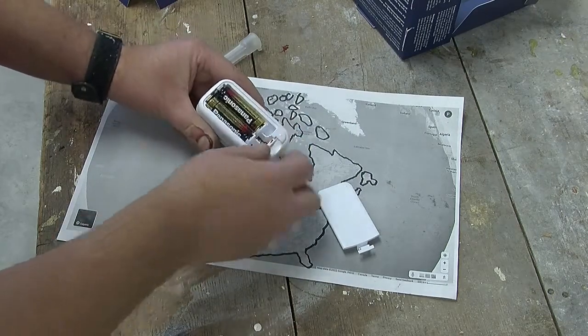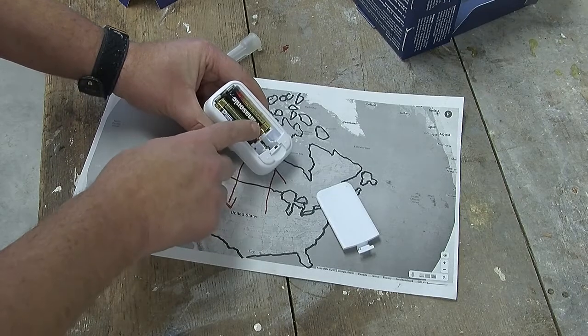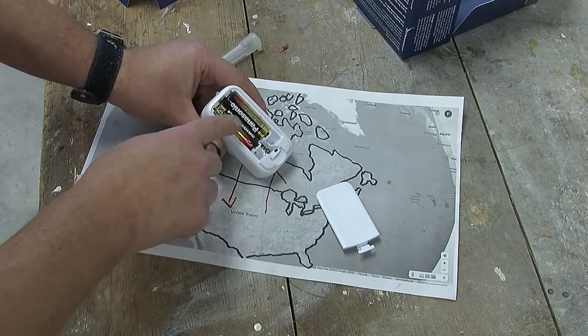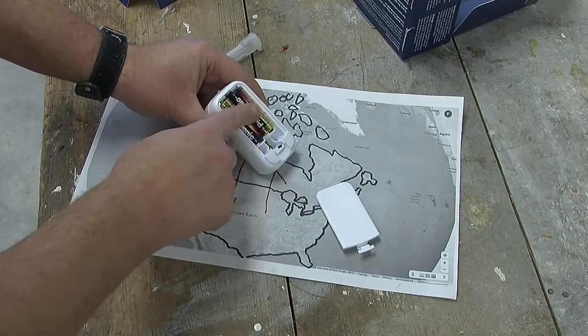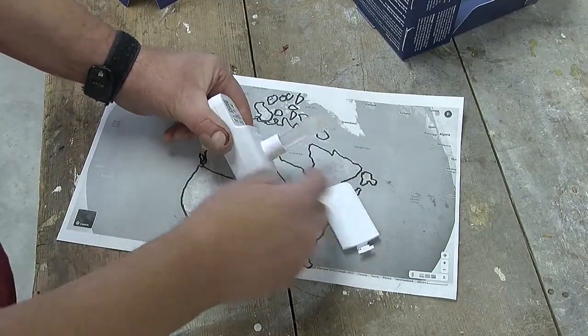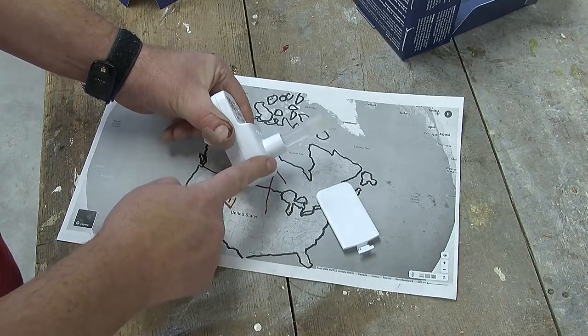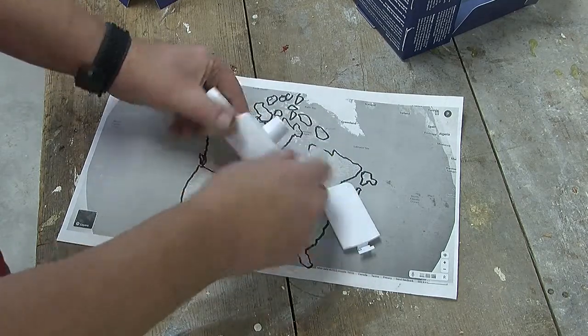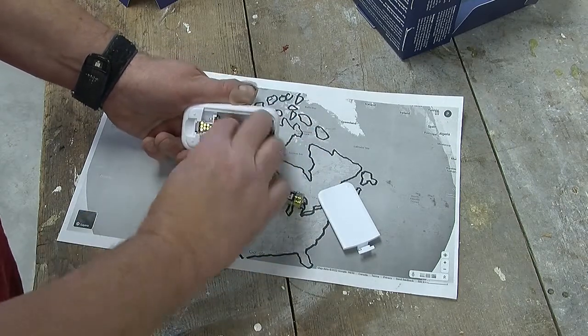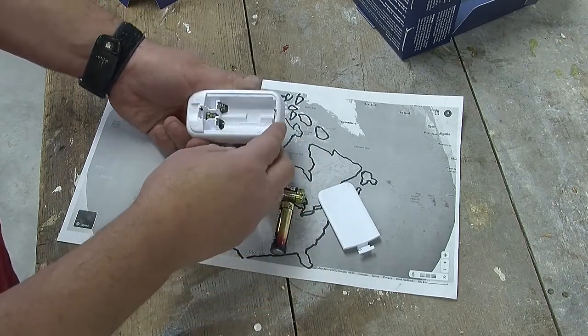One thing worth pointing out is when I did the actual test, when I was done, the batteries that they had supplied were quite hot, because it had obviously used a lot of power to keep the stuff in the vial at the correct temperature. So now that we know the electronics are still working, let's open it up and see what's inside.